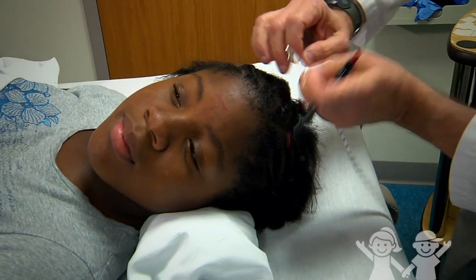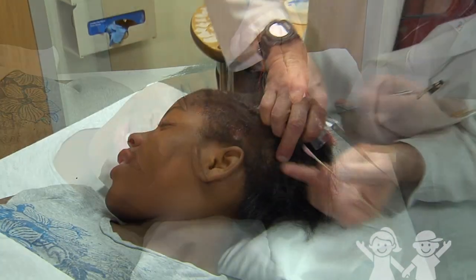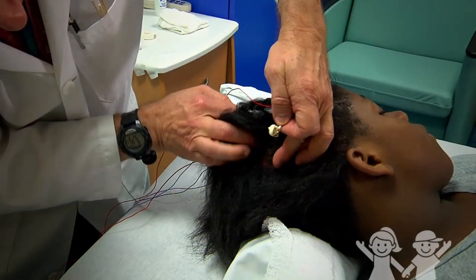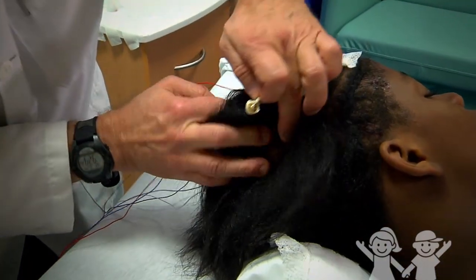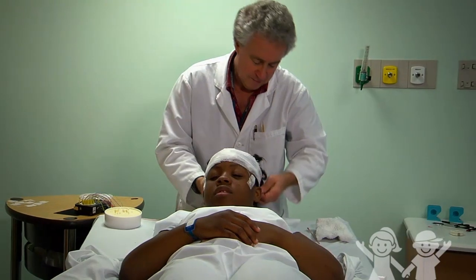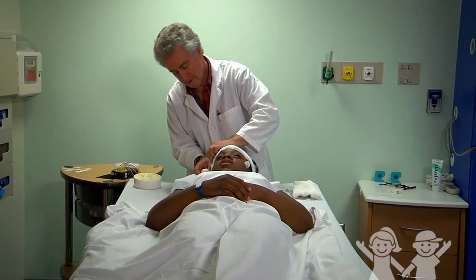When you have an EEG, the technician will make little marks on your head with a wax pencil. Then those marks will be scrubbed with a gritty gel. After that, you will get about 20 sensors placed on your head with some gel to keep them in place. Then the technologist will wrap your head up with some gauze to keep the wires from moving.